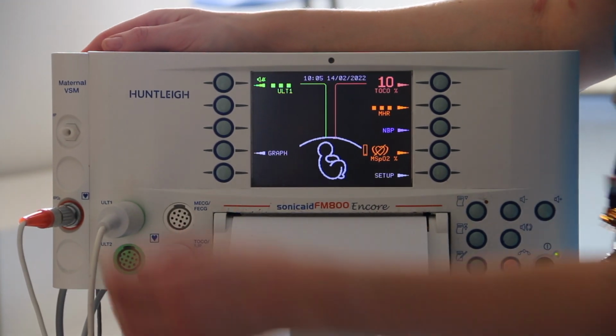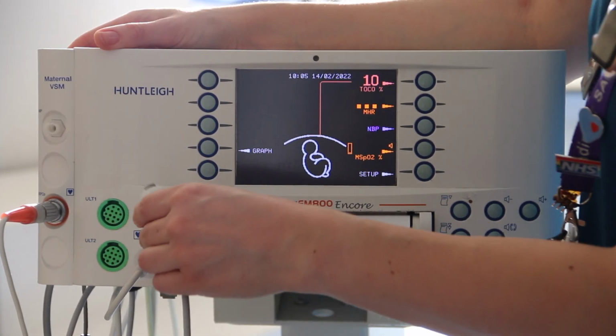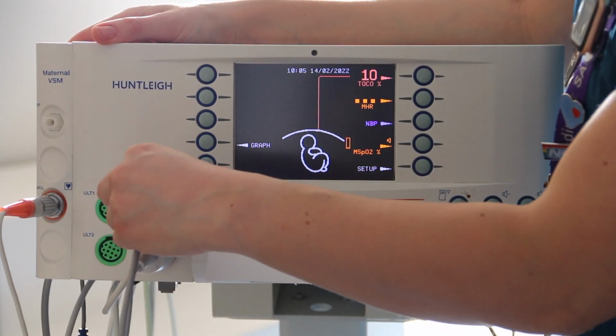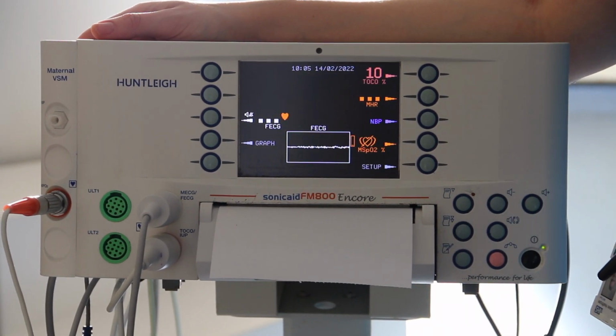To switch to an FSE, you need to unplug the abdominal transducer, ultrasound 1, for a singleton, and plug in your FSE lead. You've got a white casing there to go in your white port there, and that's really important, and you might need to switch the audio over, or it might do it automatically.